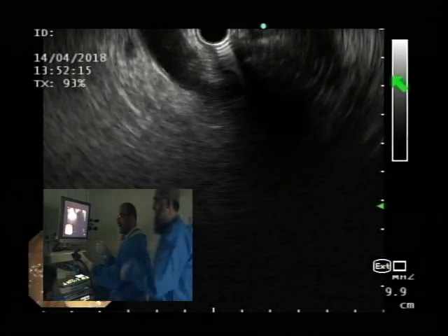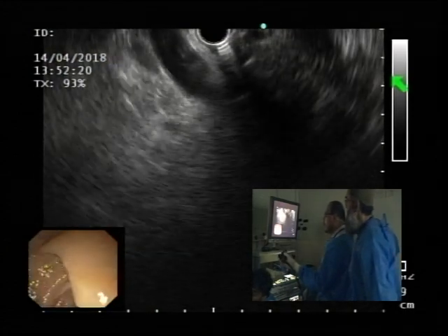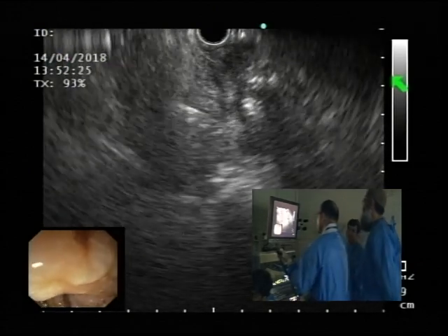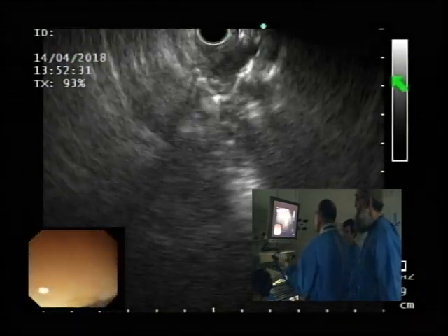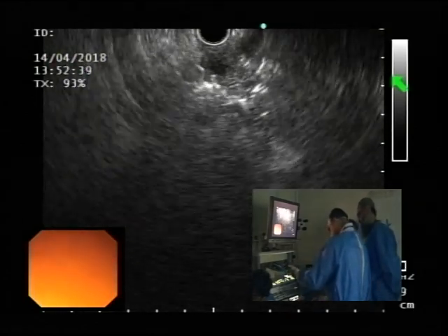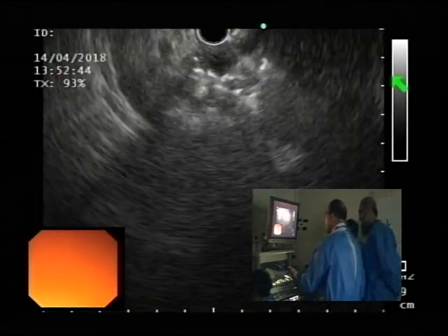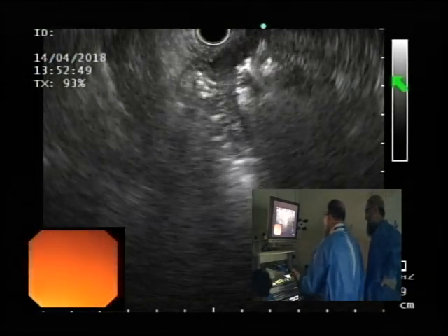Do the ultrasound. For stability, it's still unlocked for now. You can sometimes lock it, but right now always start unlocked. It's unstable, so as I go clockwise, it makes me more stable. My tendency in ultrasound is that for the second portion I actually turn this way. That stabilizes me, and then I reduce some more. After that my right hand is supporting my scope, and my left hand is doing counterclockwise and clockwise. And as I do that, I obtain my views in the second portion.